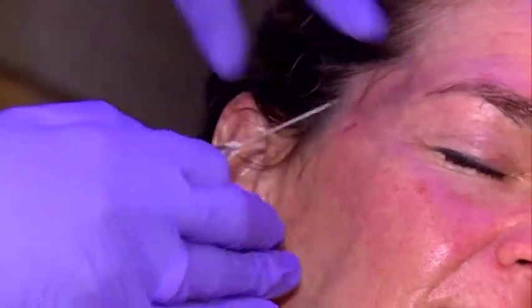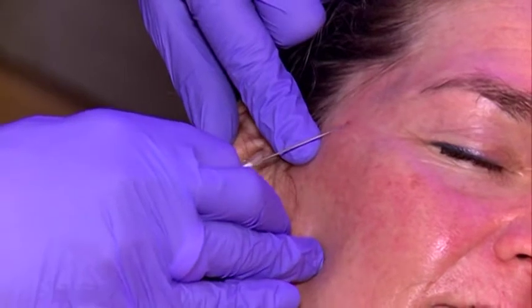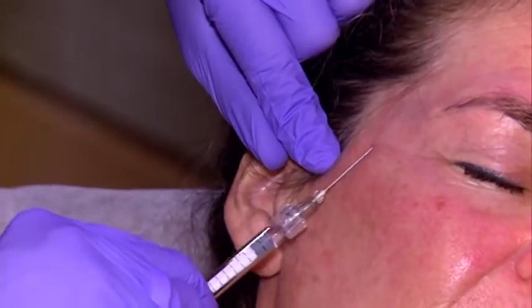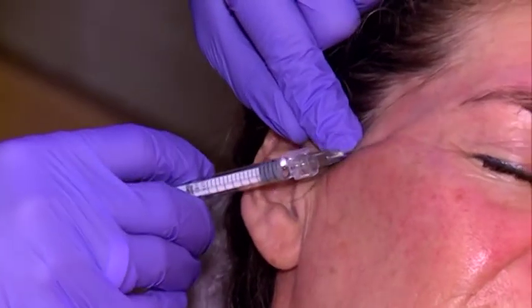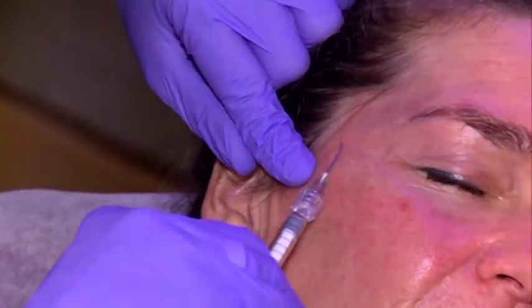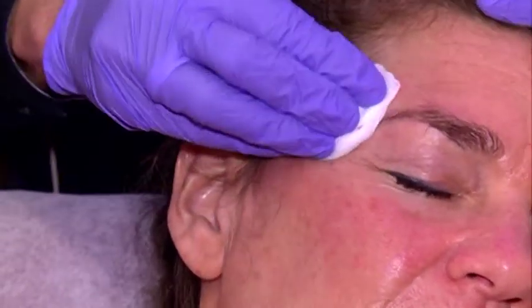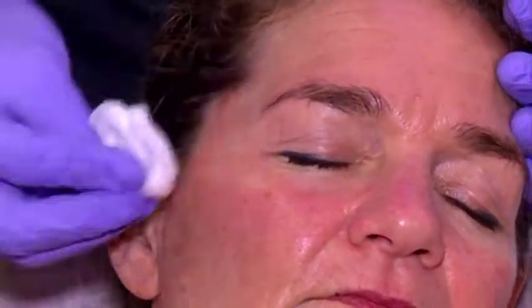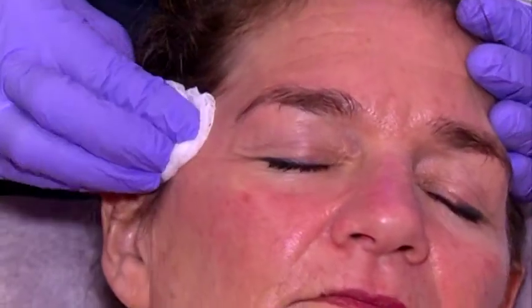Does it matter what the bevel of the cannula is? Yes, it matters, and I try to be with bevel up. Bevel up, okay. So far you've almost used 1 mil, right? Yes, she was very hollowed. Hollow, yeah. So 1 mil is what I have calculated. When I saw her on the picture, I thought I needed 2 mils, but I think 1 mil is fine. It's a huge area, and we have to augment it.